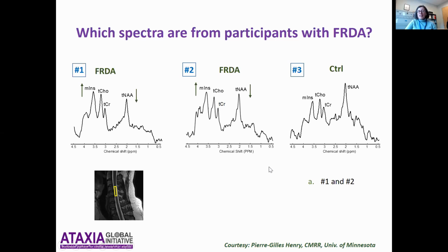Okay. So yeah, you probably noticed the NAA peak relative to the other ones is lower in these two cases, and the myoinositol relative to choline creatine is higher. The NAA myoinositol ratio is quite different. And these are, as I said, not great looking spectra, and many of you have not done spectroscopy before, but on an individual subject basis, you can see the differences.